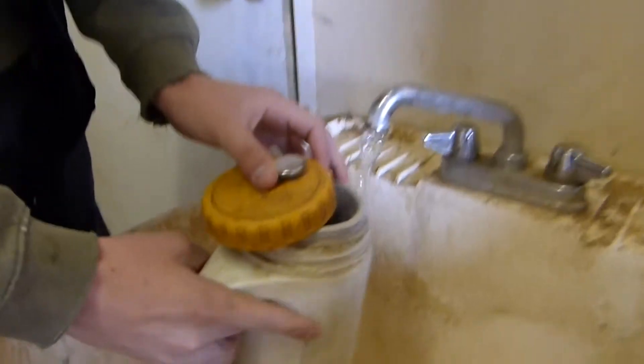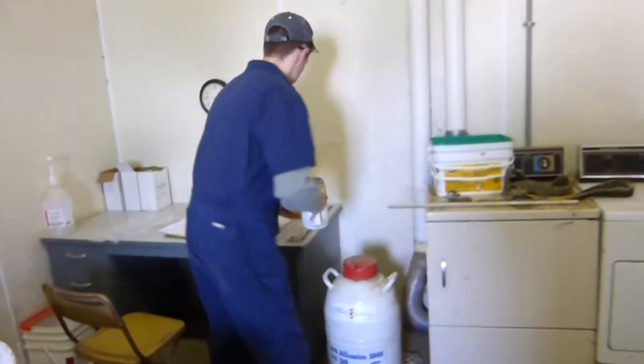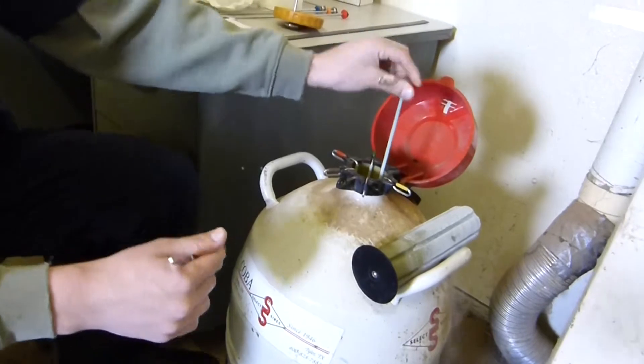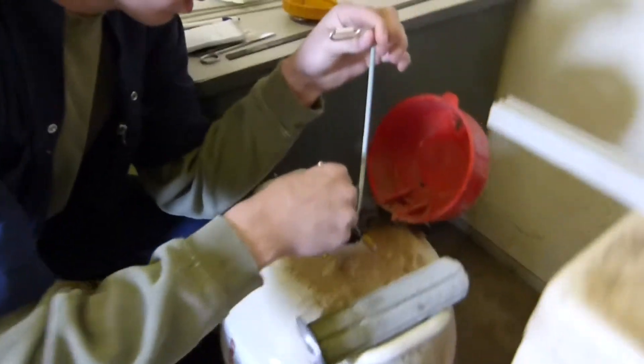After I've selected the semen I will go over to the sink and fill the thermos with 95 degree water. After I have my thermos filled I go over to the nitrogen tank, where the semen is held, and I find the semen that I have selected earlier with the selected sire.